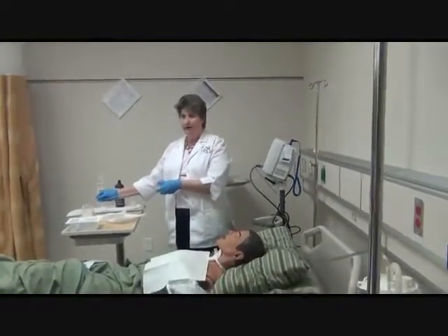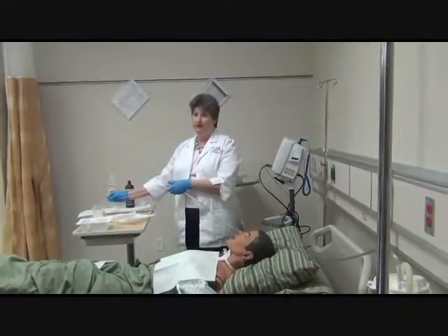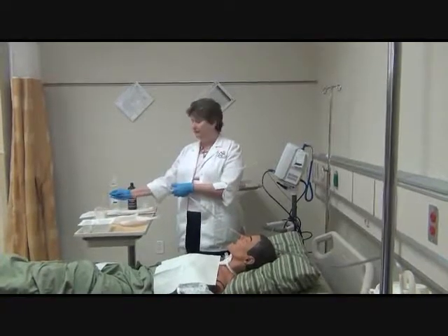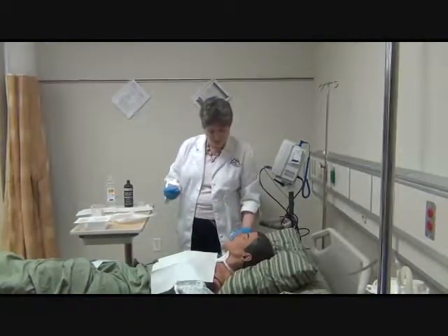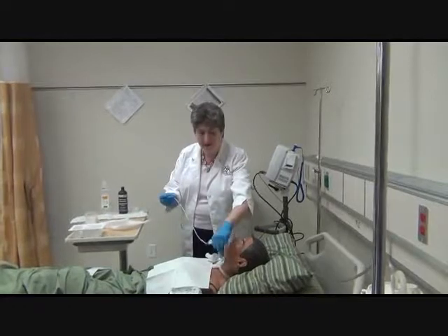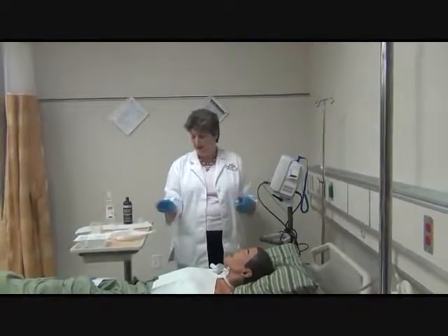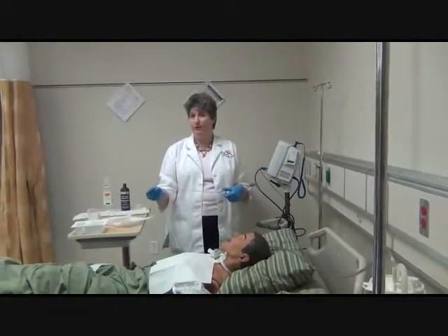We're going to come back and we're going to irrigate with the sterile water. Now, this water got contaminated with bacteria, but it's bacteria from the patient. I didn't pick it up off of the countertop, the floor, the sinks, the toilets, or anything like that. I'm going to, with my unclean hand or unsterile hand, again, allow him to reoxygenate.